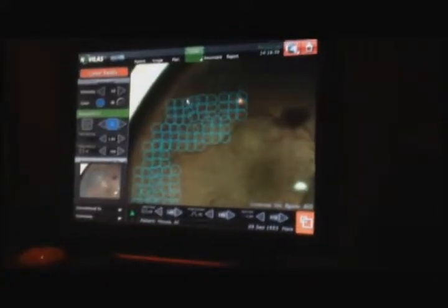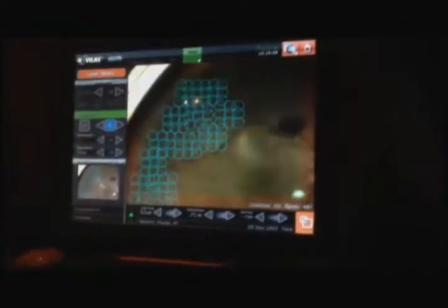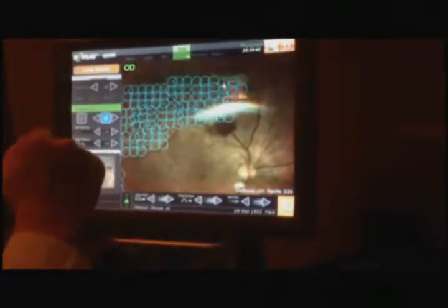I'm showing you panretinal photocoagulation with prepositioning of arrays of laser applications. The prepositioning can be carried out using either a joystick on a computer or a touch screen. By using that, we target the areas of leakage or non-perfusion and any additional retinal areas with ischemia. In this case, we can see local intraretinal hemorrhage with proliferative diabetic disease, which required panretinal photocoagulation.